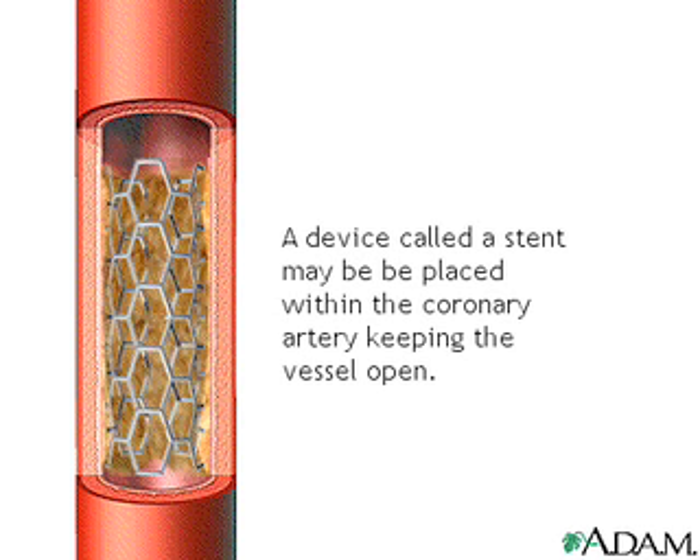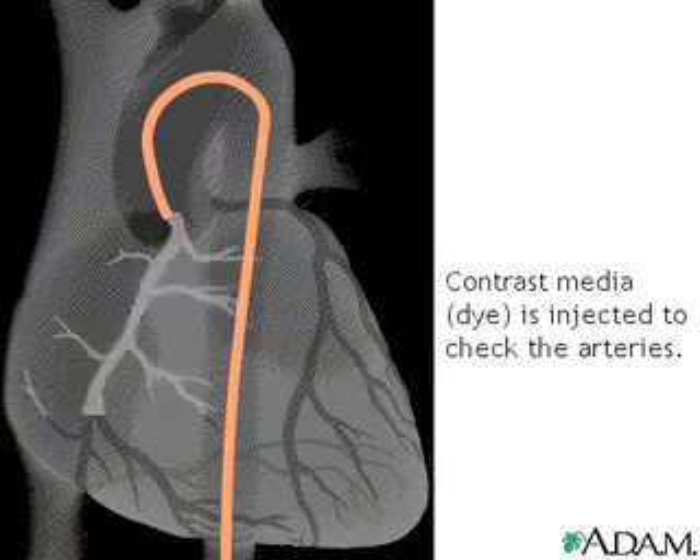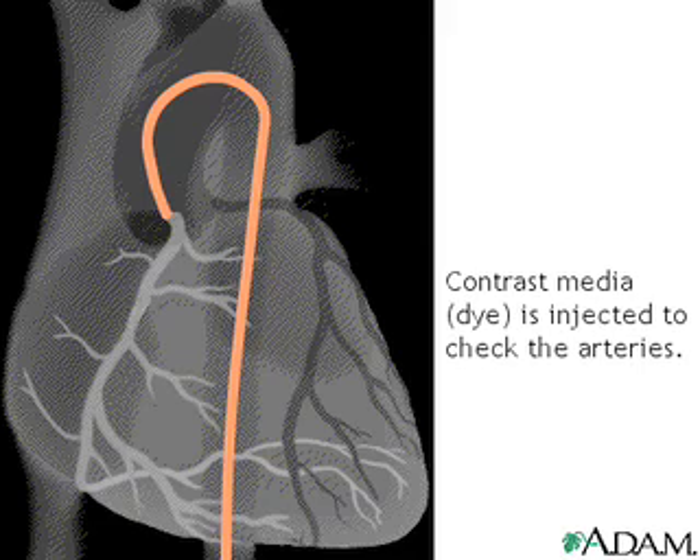A device called a stent may be placed. This is a latticed metal scaffold that is placed within the coronary artery to keep the vessel open. After the intervention is completed, the doctor injects contrast media and takes an x-ray to check for any change in the arteries.